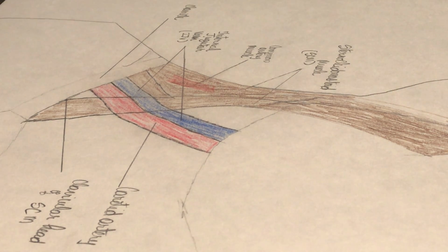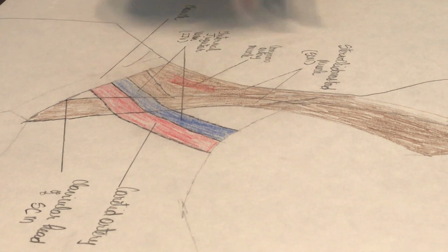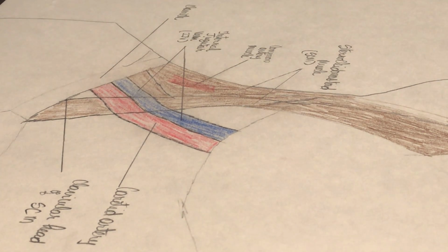I'm a student nurse practitioner, and today I'm going to insert a central line, and the site that I'm going to use is the internal jugular. The indications for this procedure are emergency venous access, administration of TPN, administration of high volume fluid resuscitation, caustic agents, vasoactive agents, and administration of concentrated fluids.